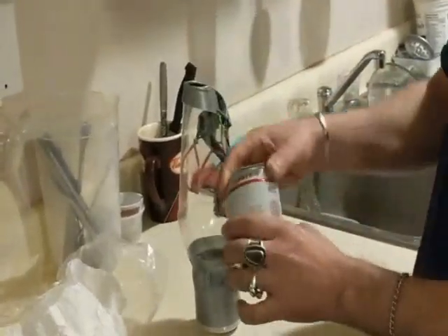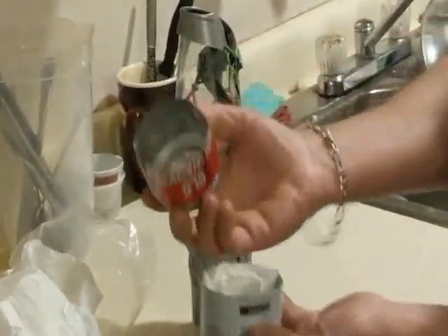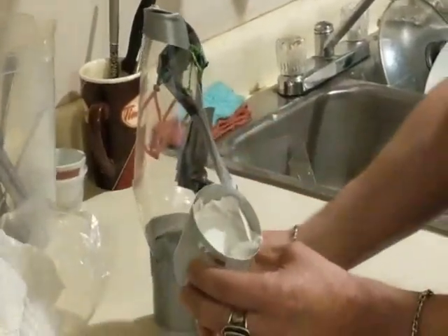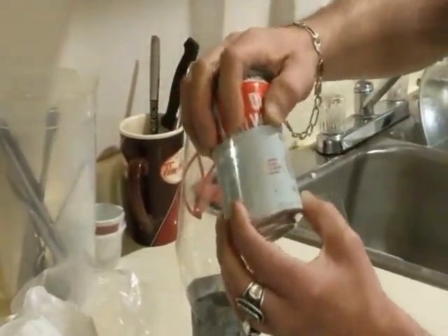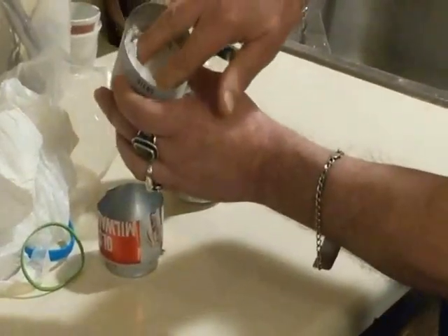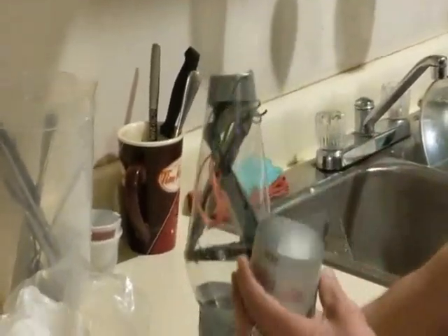This is one of the best filtration masks that I've made and that I've seen. You can close it with the other part of the beer can, like I'm showing you. It's easily closed and easily opened. I'm going to show you exactly what's in the contents of the beer can, which is the filtration. I put slits into the beer can so that I can put the top lid on and close it along with a piece of duct tape to keep it fresh from spoiling. You can make several of these and store them away for future use. And it attaches to the mask, the 2-liter pop, with duct tape, as you can see.